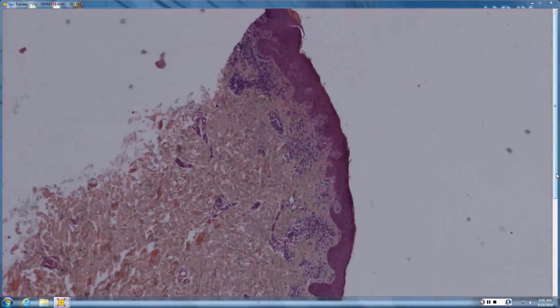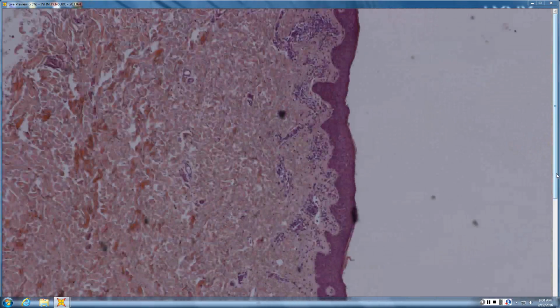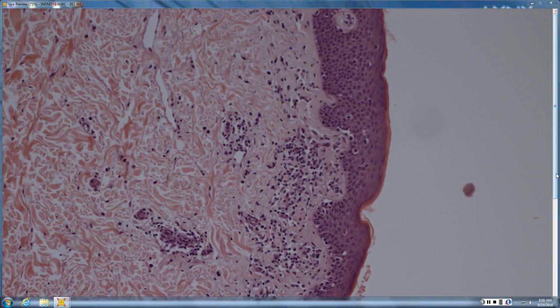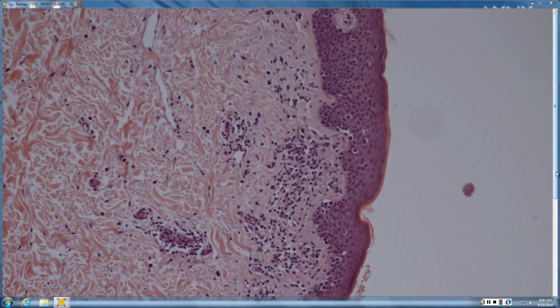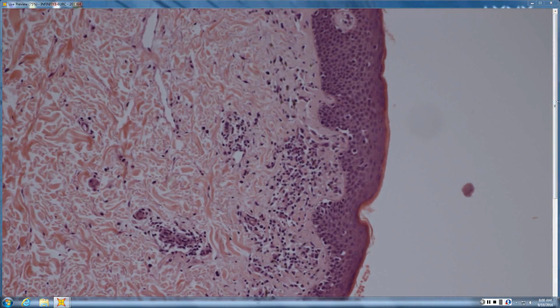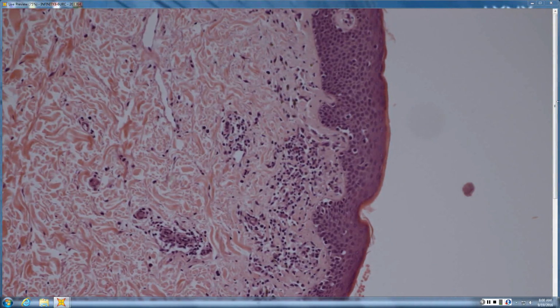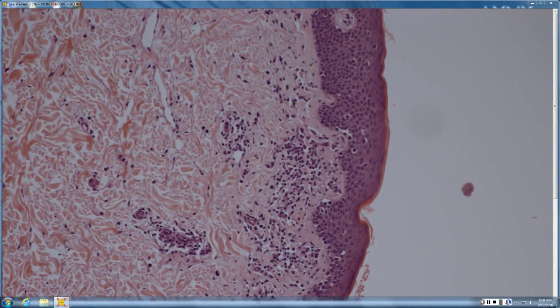You have a punch biopsy. Looks like there's a lymphoid infiltrate in the papillary dermis, and appears to have some vacuolar change. So vacuolar change. And are you seeing lots of vacuoles without lymphs, or is there a lymph in every hole? It looks like a lymph in every hole. So lymph in every hole. And with the epidermotropism, I would think about possibly MF. So there's a lymph in every hole, and how big are those lymphs compared to the lymphs down below? They are bigger.